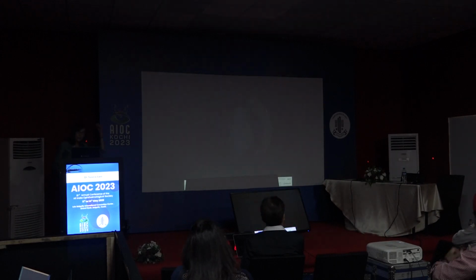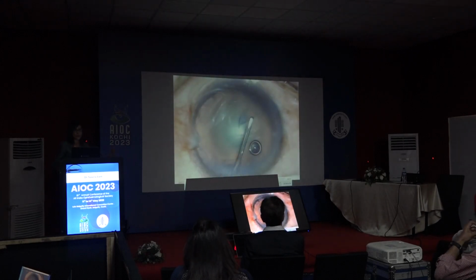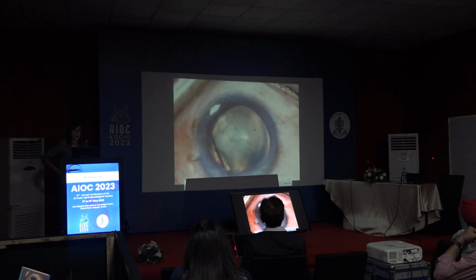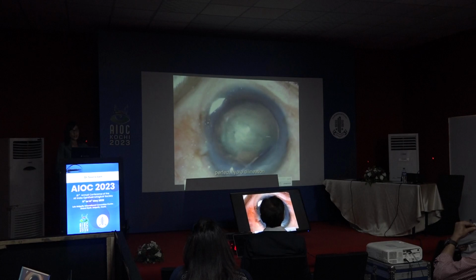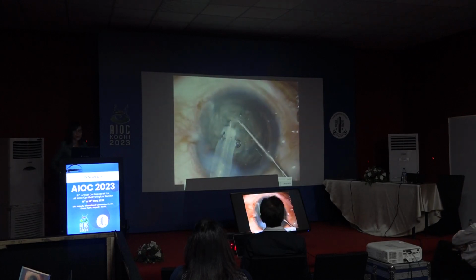This was a live surgery done about 3 years ago in Bhopal, wherein I said, all right, I'll operate on a polar cataract. There is a very dry cornea, so you could see an epithelial irregularity. A well-done hydrodissection, hydrodelineation after a carefully performed rhexis. Hydrodelineation is good. It's just an NS2 cataract, and I thought, what the hell, it's going to go really well.